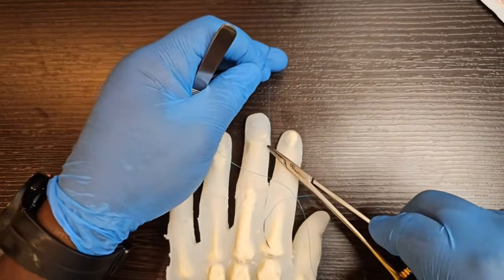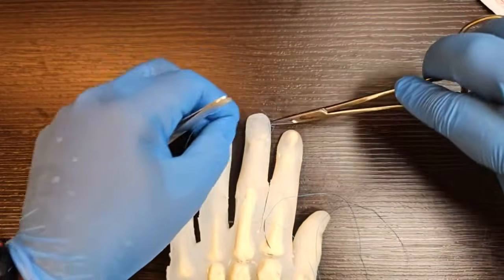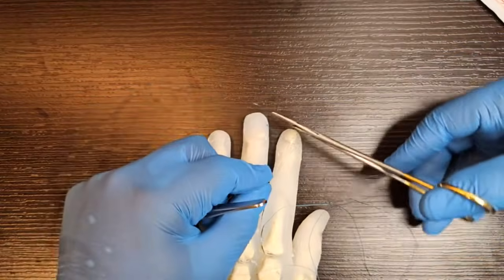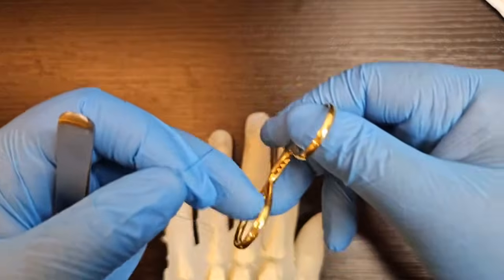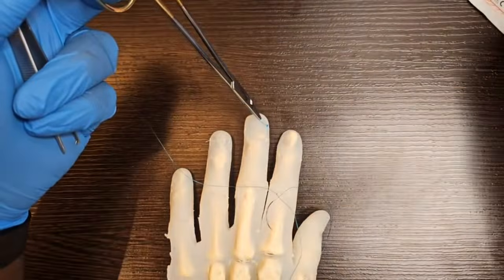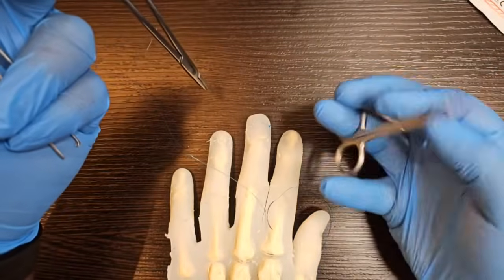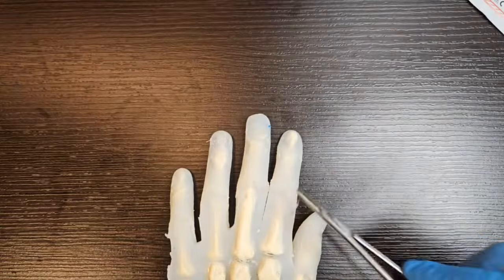Lay a square knot. Alternate their position. In the last live session we talked about the scissor technique. Cut. And go again.